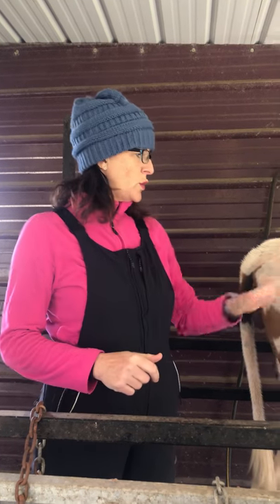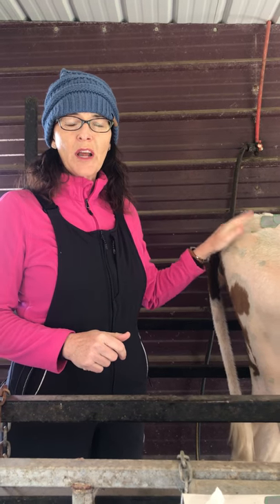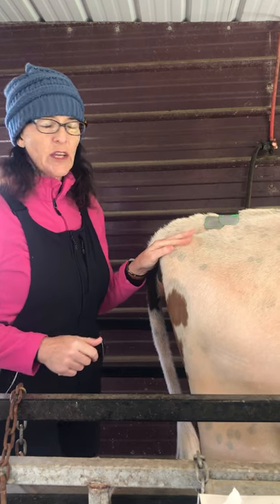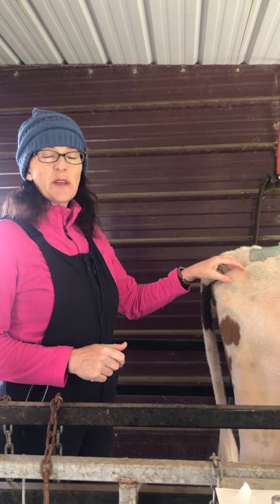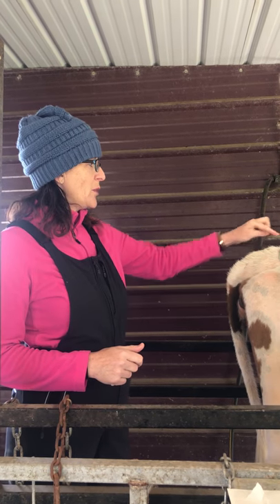Today we're going to prepare this Ayrshire heifer for breeding where we're going to artificially inseminate her, so we need to have a time. She's not showing heat well for us, so we're going to manipulate her hormones to know when she's going to ovulate so that we can breed her and get her bred.